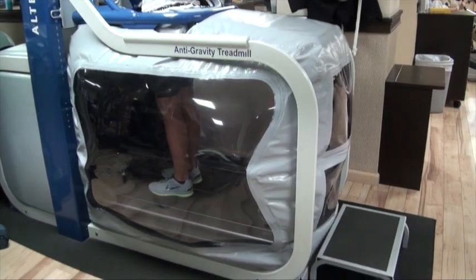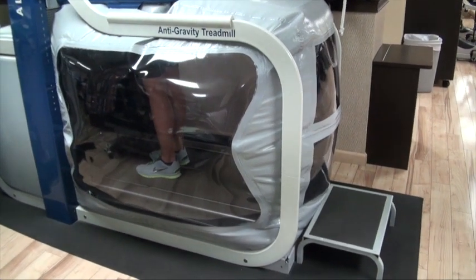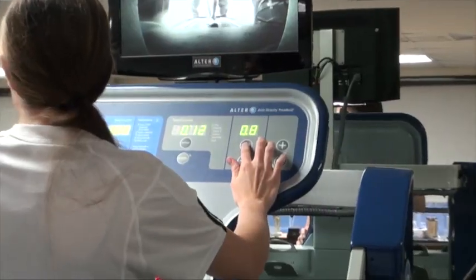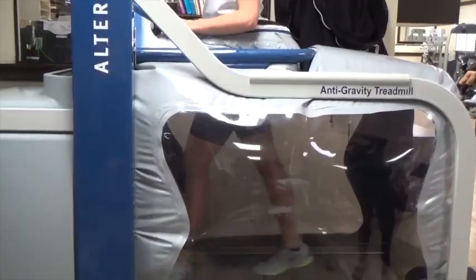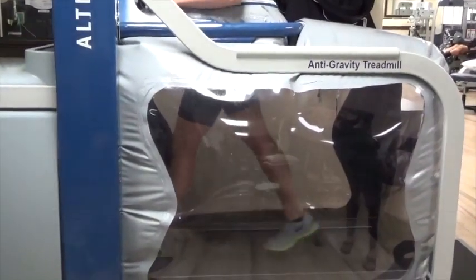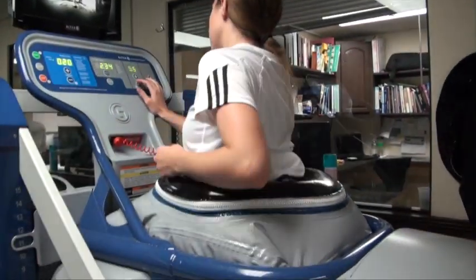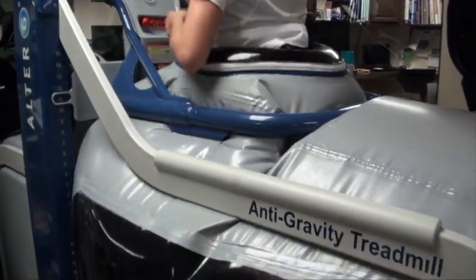Once locked in place, the treadmill calibrates for the patient's weight. The desired percentage of support can be set, followed by the speed. The monitor screen allows the patient to view their biomechanics, which provides for greater motor learning through visual feedback.